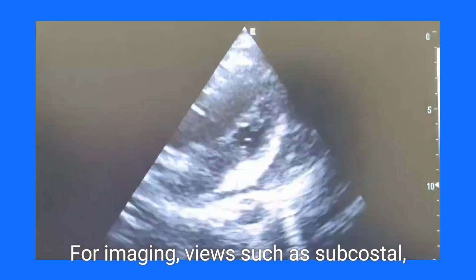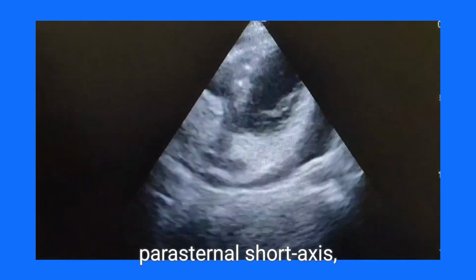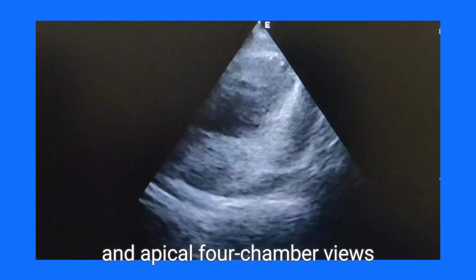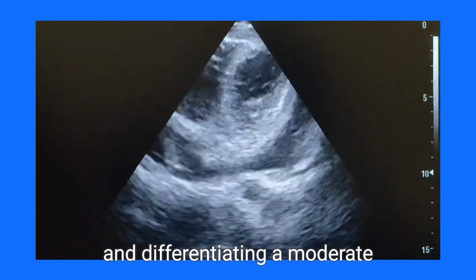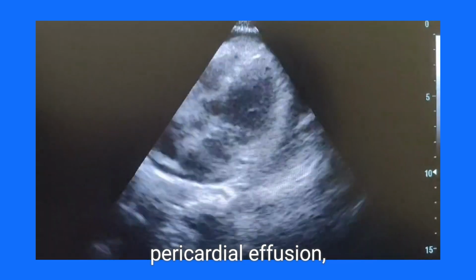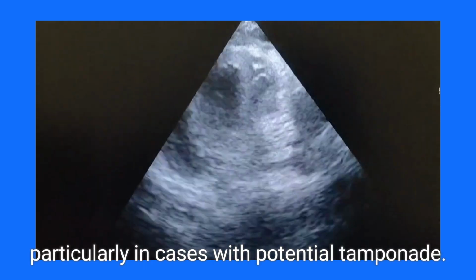For imaging, views such as subcostal, parasternal long axis, parasternal short axis, and apical four-chamber views are essential for diagnosing and differentiating a moderate pericardial effusion, guiding appropriate management, particularly in cases with potential tamponade.